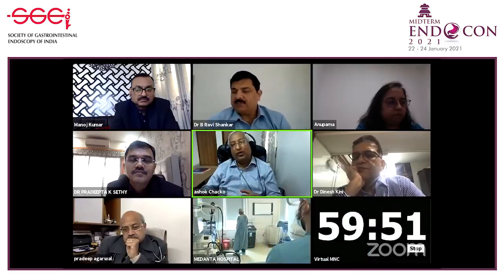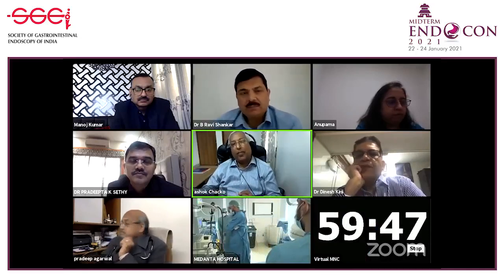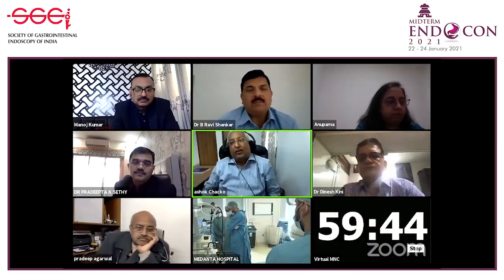So that is the first question. The second, more easy, is if it is retained in the stomach, we can go in with a Roth net and take it and put it into the duodenum, or even a basket. You can take the capsule and place it into the duodenum. And now we have real-time viewers, so it is better to look at the capsule in real time till it goes into the duodenum. So that is easy to move out.